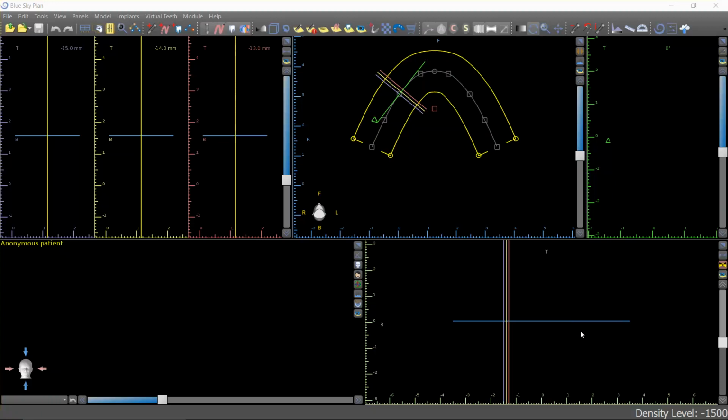In this video, I'm going to be going over case number 1. So this is the first case in our example cases, and we'll go through more of the basics in this one and get more advanced as we go on.